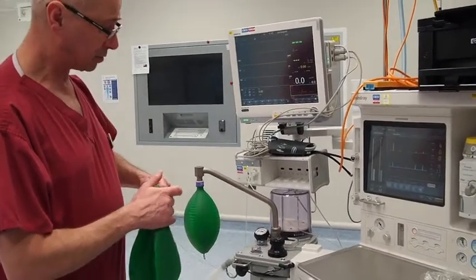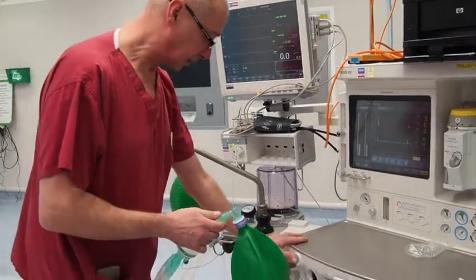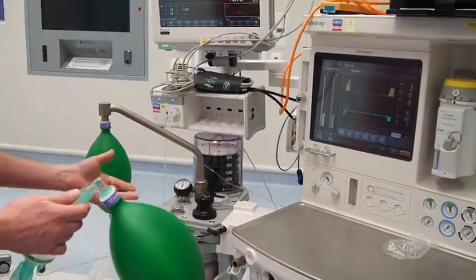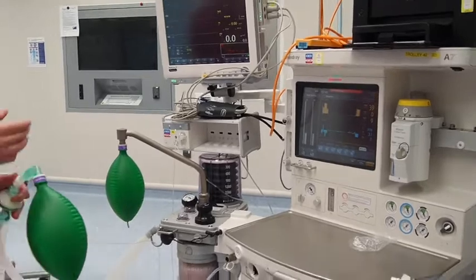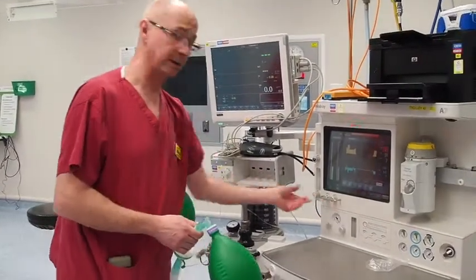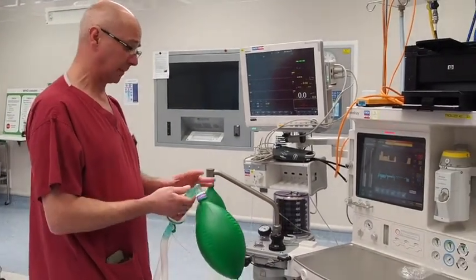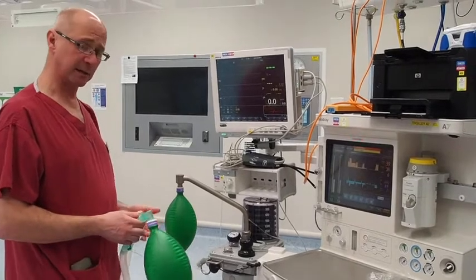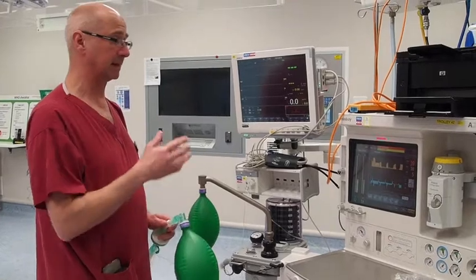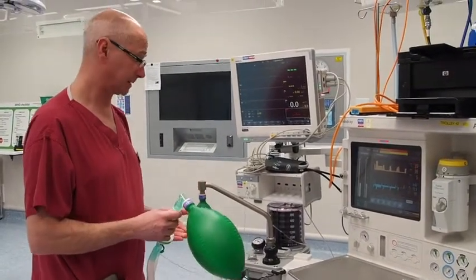If you've had a disconnection or there's a leak somewhere in the system, the fastest way to get around it is to press the oxygen flush button and just keep pressing it until the bellows are full. And if your bellows keep recurrently collapsing, then turn the flows up here until you work out where the leak is, because you've got a leak somewhere in the system. It might be around the tube of the patient, or it might be a leak somewhere. ITU ventilators cope with these leaks much better and much more automatically than these anaesthetic machines do. And that is the real way you're going to get caught out with these machines.